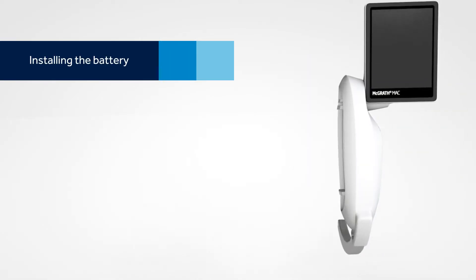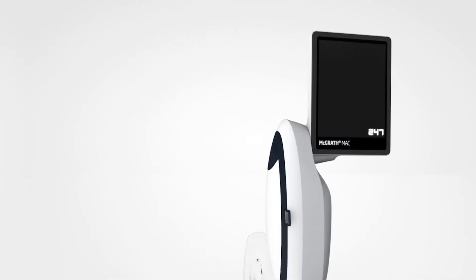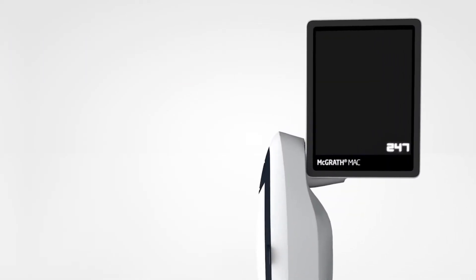To get started, place the proprietary lithium-ion battery into the device and press the ON button. A countdown appears, indicating how many minutes you have remaining on your battery.